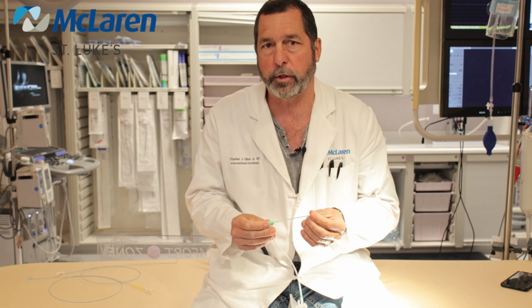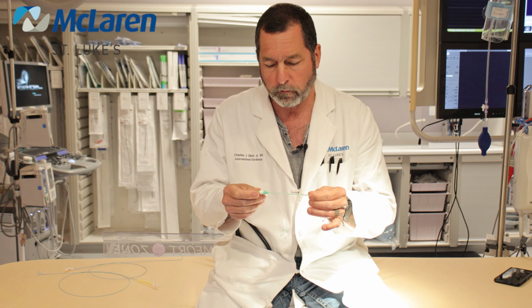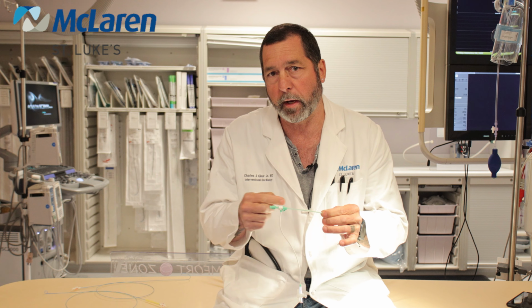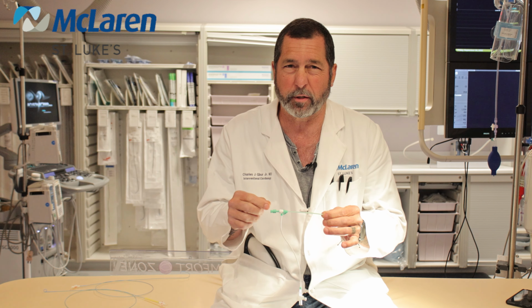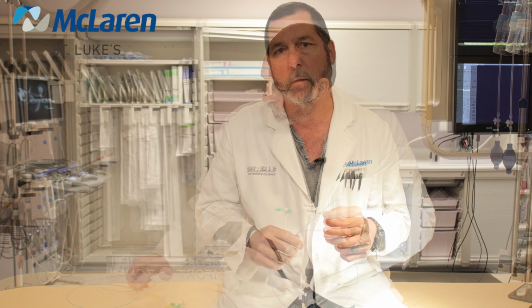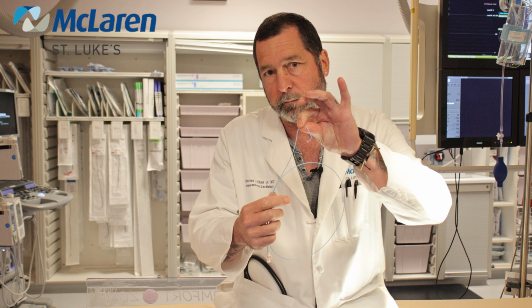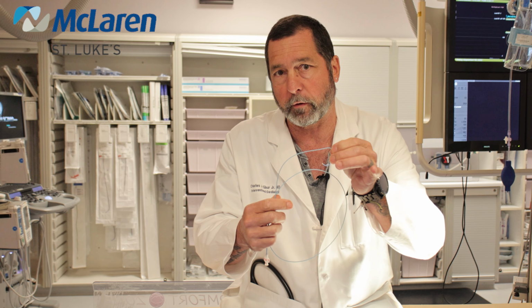And then once you're in the lab, we'll either go into the artery, usually in the wrist, but sometimes we can also use the femoral arteries in the groin. We insert a small tube called a sheath into the vessel. And this has a little valve on it that prevents blood from flowing out. And we can put our catheters in through that so we don't have to keep basically sticking you in the vessel. We then put small catheters through that tube that go up into the heart, and they have different shapes and forms basically to fit into the heart arteries.